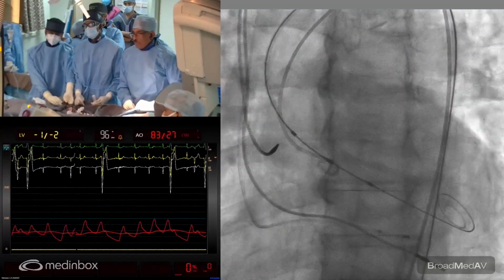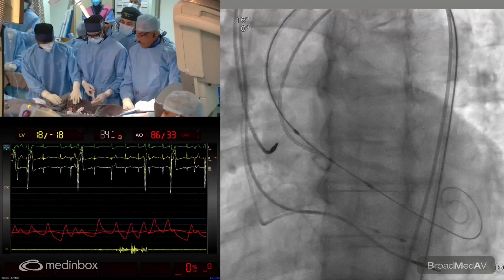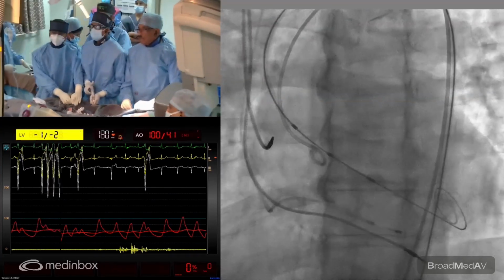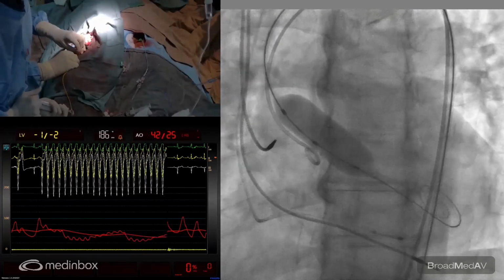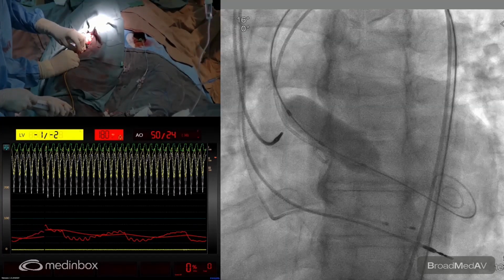You can see it's quite hard to go through. Okay, so that's good. Fix the wire, please. And Ravi, please pace. Are we injecting? Okay, go up, please. Okay, that's fine. 1001, 1002, 1003.